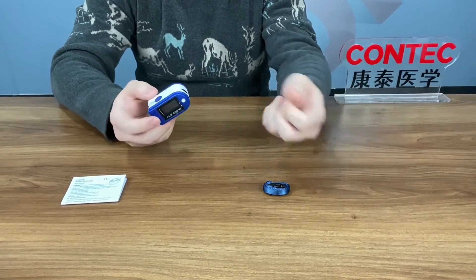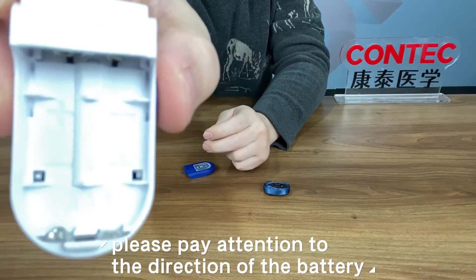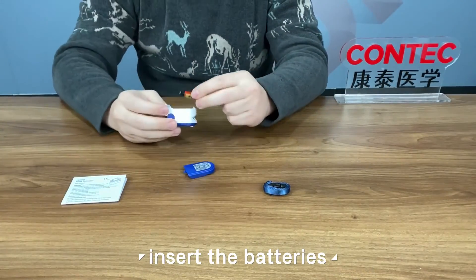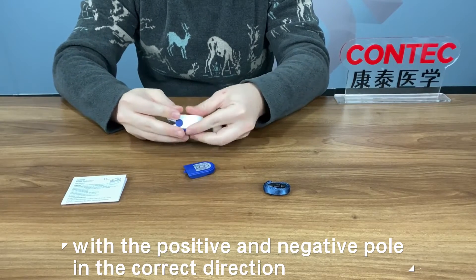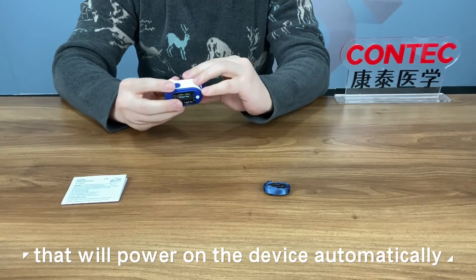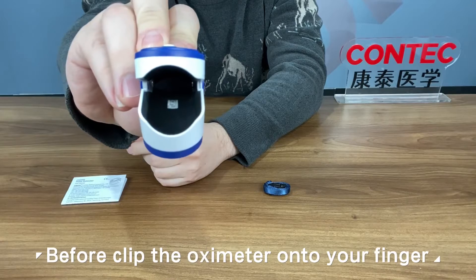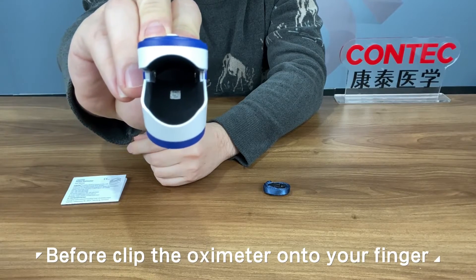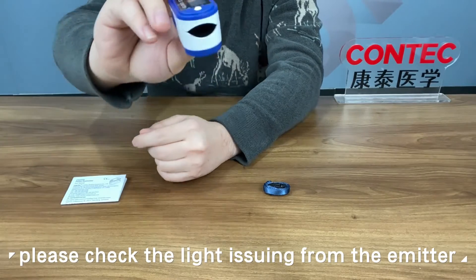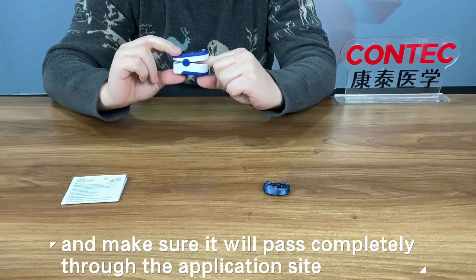Let's try the device. Remove the back cover — please pay attention to the direction of the battery. Insert the batteries with the positive and negative pole in the correct direction. That will power on the device automatically. Close the back cover. Before clipping the oximeter onto your finger, please check the light issuing from the emitter and make sure it will pass completely through the application site.